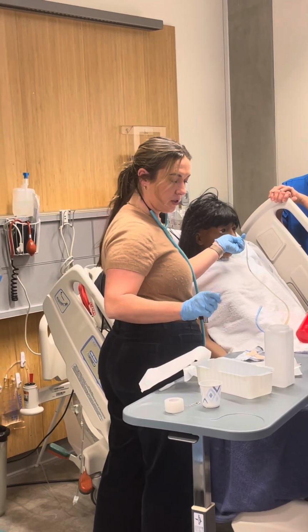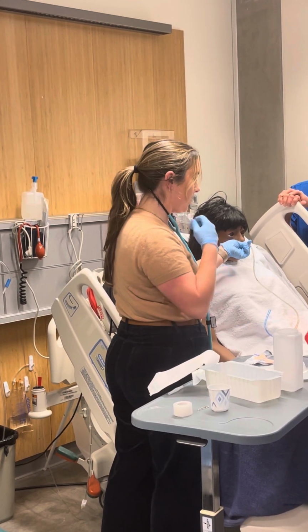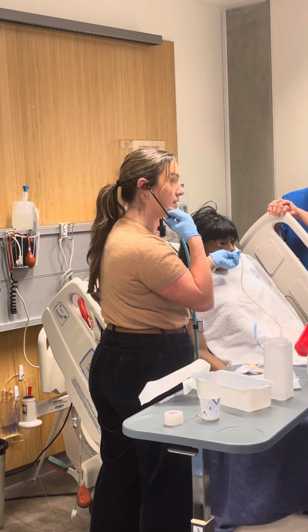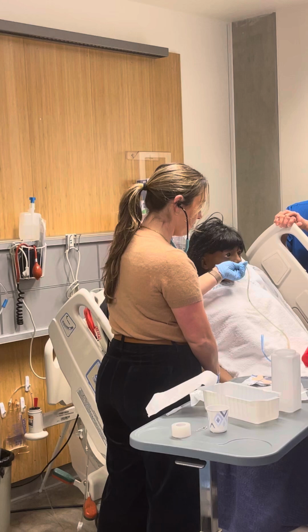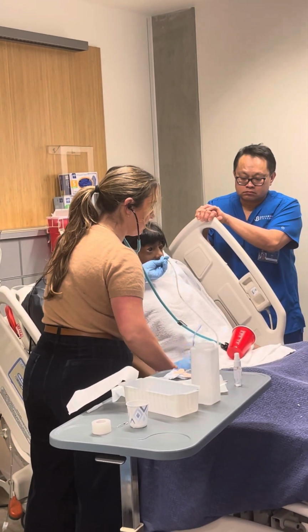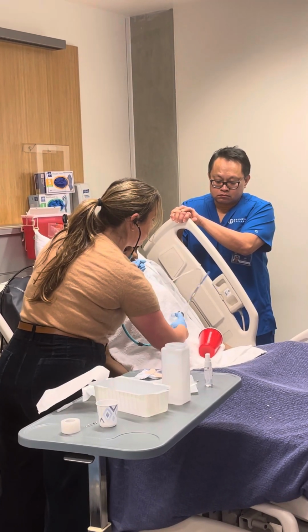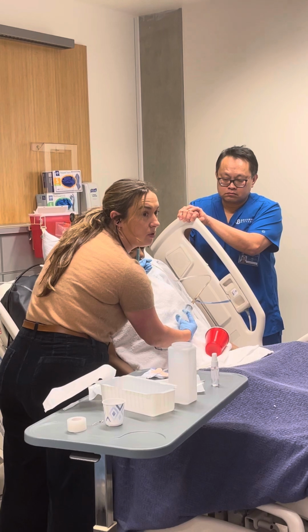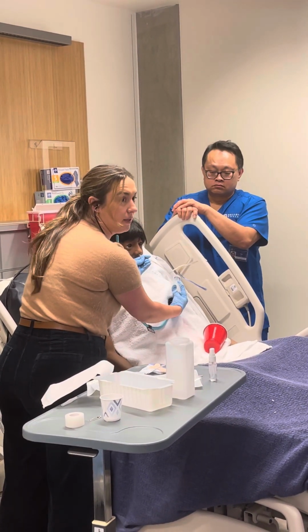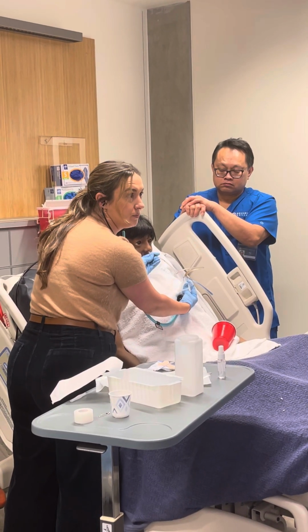So now I'm at 60. I'm going to hold it here because I don't know that I'm in the right place. I'm not going to secure it yet. One way to check is, this is why I do this ahead of time. I'm going to have maybe a buddy hold this here, or I'm personally going to do this. As I inject air, I'm listening for a burp sound over the stomach. If you don't hear that, maybe go a little higher, inject some more air, and if it sounds like a breath sound, you're in the lung. You need to come out.